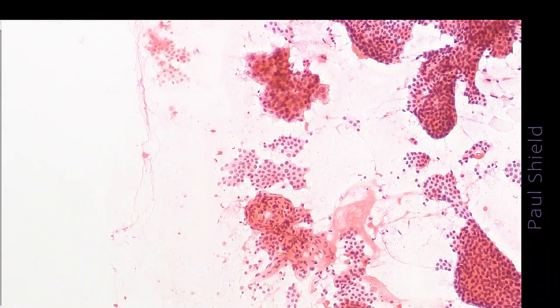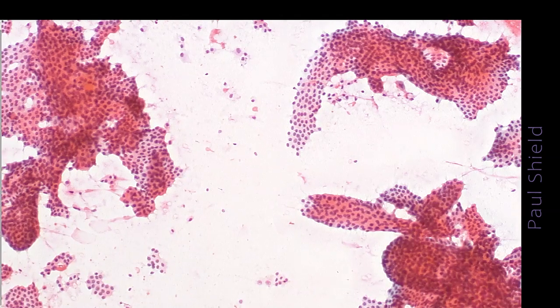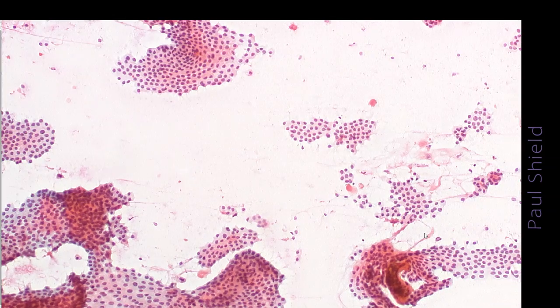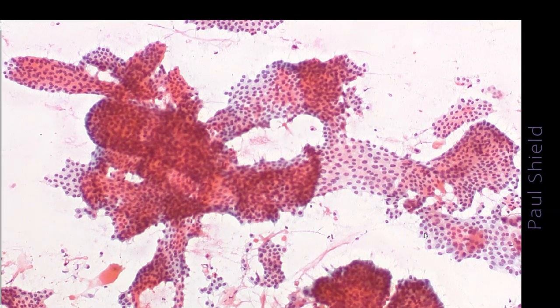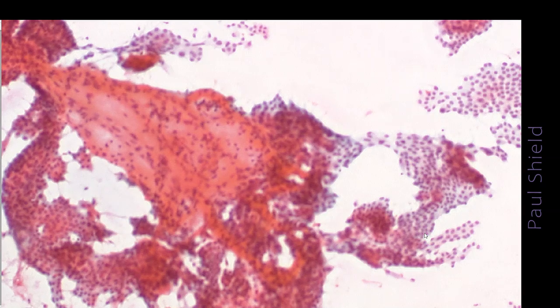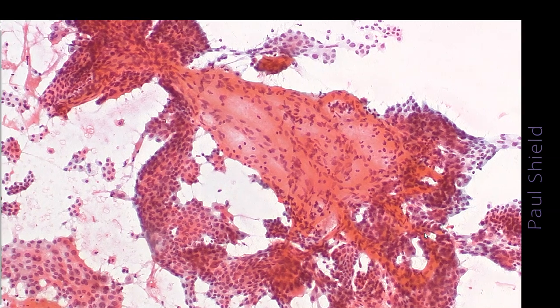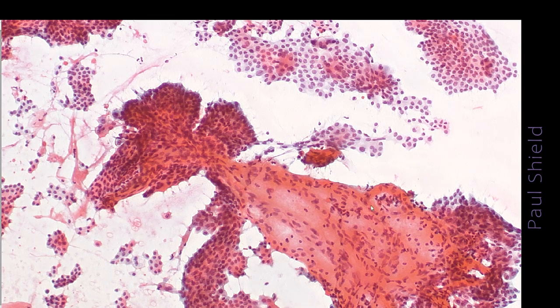Let's look at cytology of a couple of cases, and here you can see these are usually highly cellular. So remember the breast papillary cancers I said were always highly cellular, so are these. You can see the same architecture we were looking at in the histo here with fronds of epithelial follicular cells, and then a lot of them are arranged like sheets, but notice that rounded branching appearance. And then this is a diagnostic area here with that connective tissue core that runs inside those papillae. And this is that fibrovascular core we were just looking at histologically.